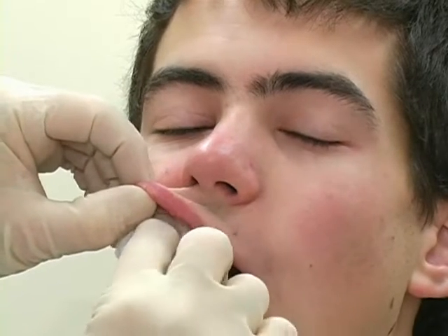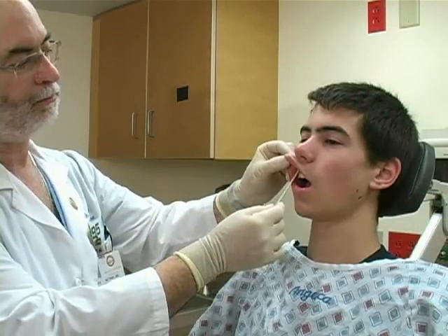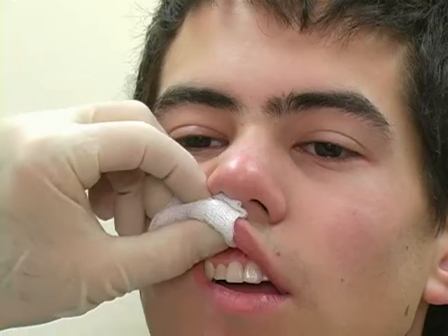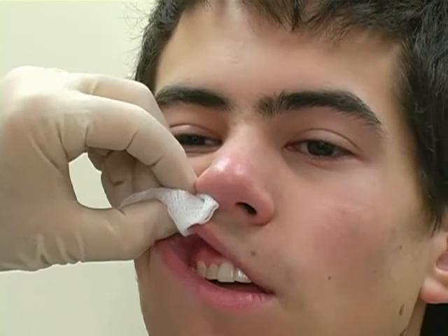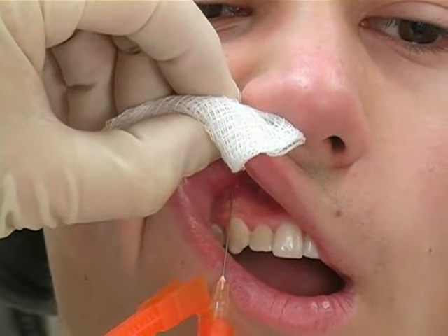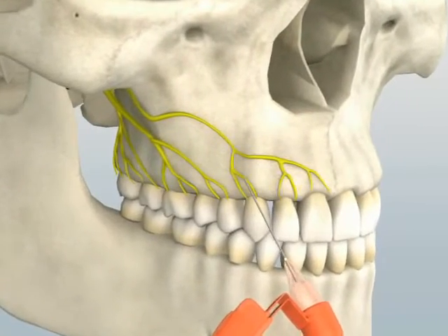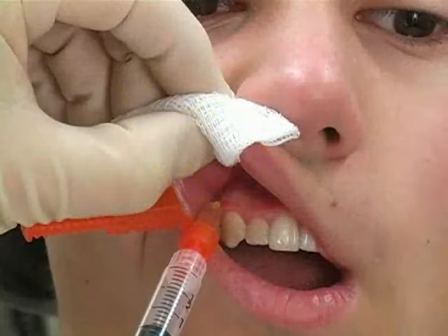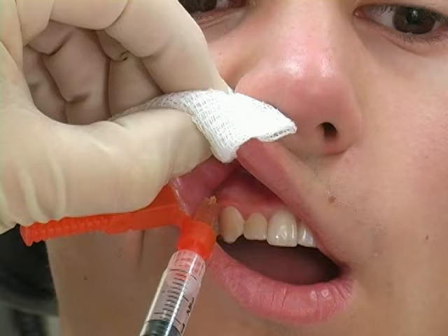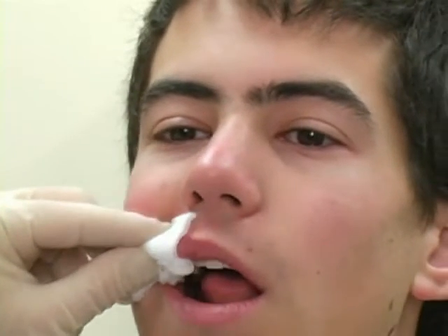Dry the buccal mucosa around the area with a piece of gauze, and then apply a topical anesthetic such as benzocaine. Instruct the patient to close the jaw slightly to relax the upper lip. Use a piece of gauze to retract the lip anteriorly. Insert a 3.5 centimeter 25 gauge needle in the mucosal reflection at the apex of the canine tooth. Advance the needle superiorly at a 45-degree angle. Aspirate to exclude intravascular placement, and then inject 2 to 3 milliliters of anesthetic. Massage the area for 10 to 15 seconds to hasten the onset of anesthesia.